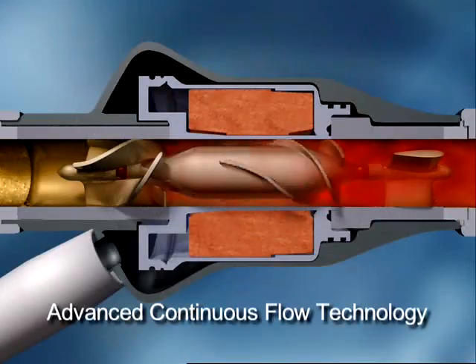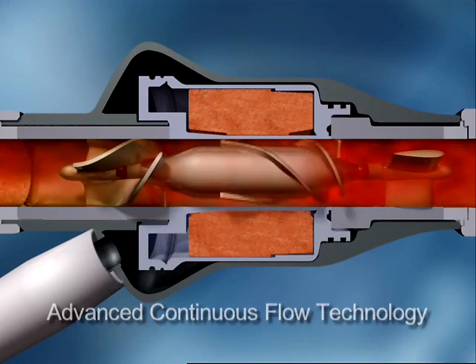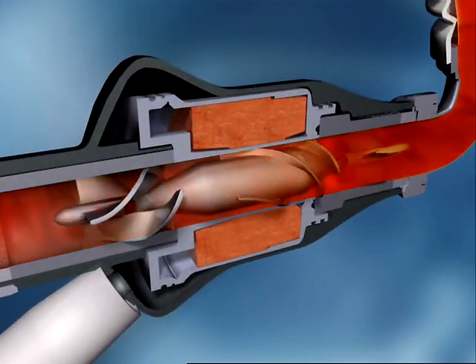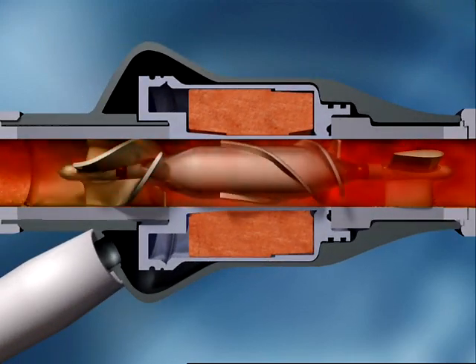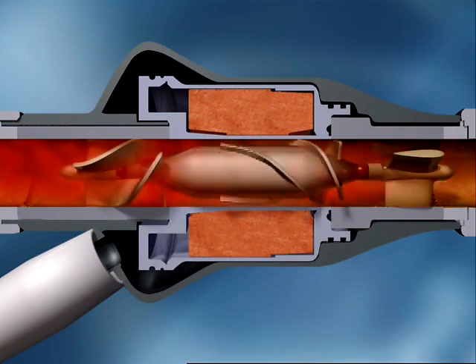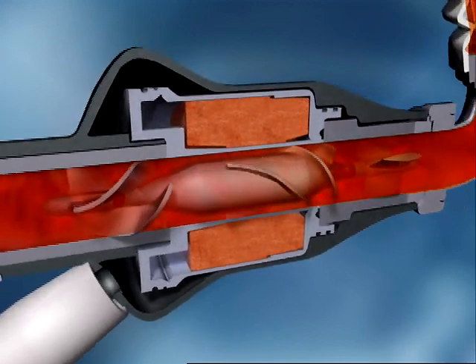Utilizing advanced continuous flow technology, the HeartMate 2 has only one moving part — a small spinning rotor that is capable of providing flow from 3 to 10 liters per minute, covering the full cardiac output of a healthy heart. As blood enters the pump, seen here in slow motion, it is straightened by the inlet stator vanes prior to entering the path of the rotor.